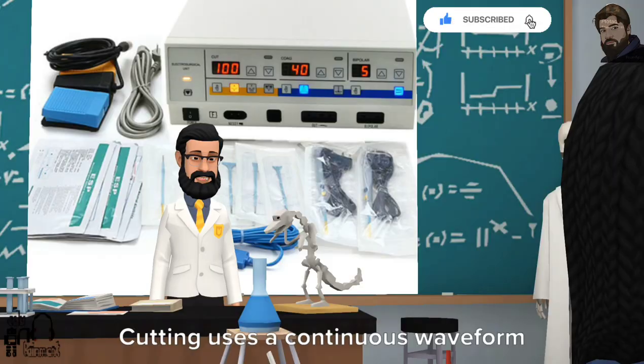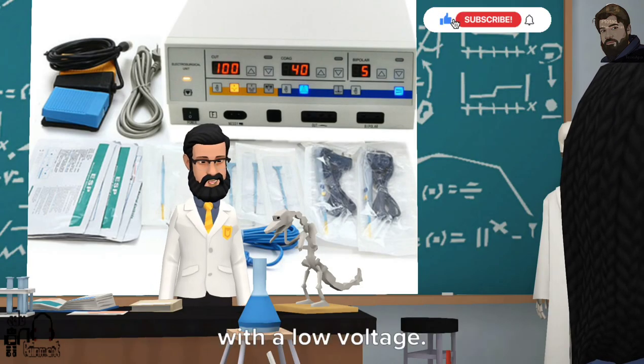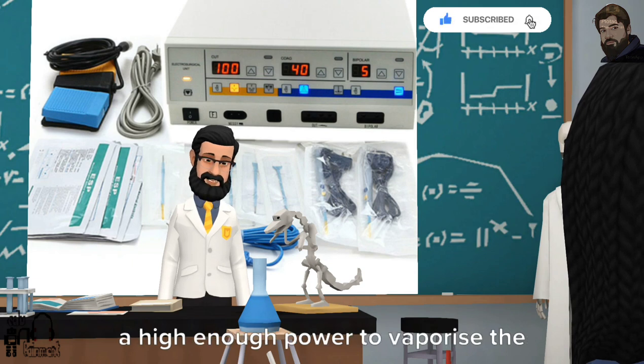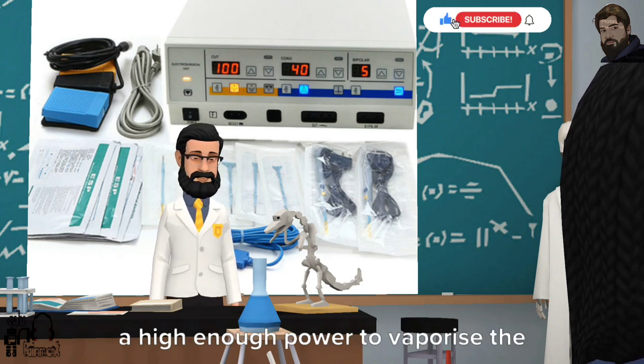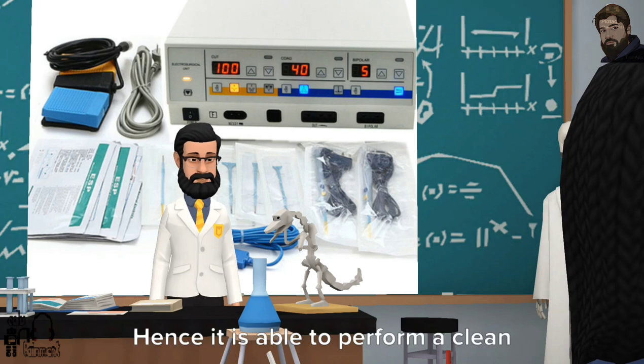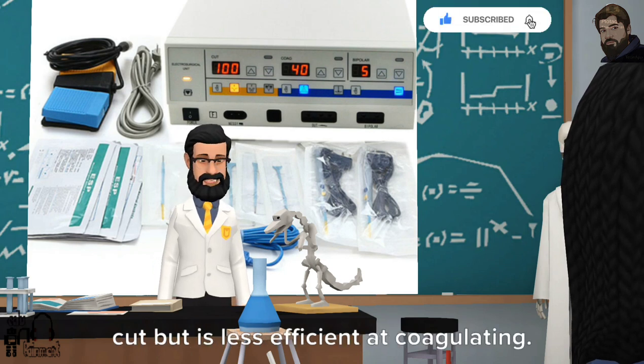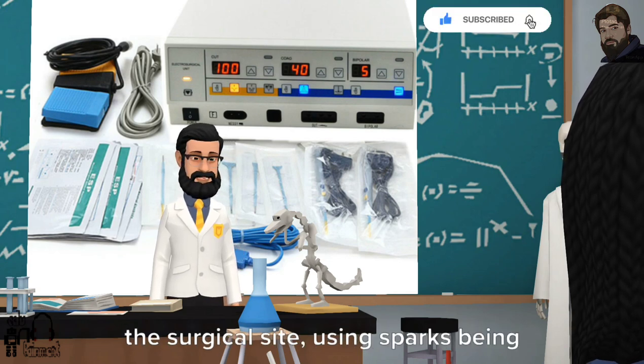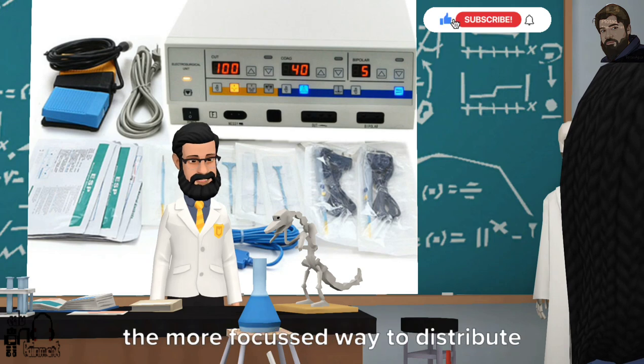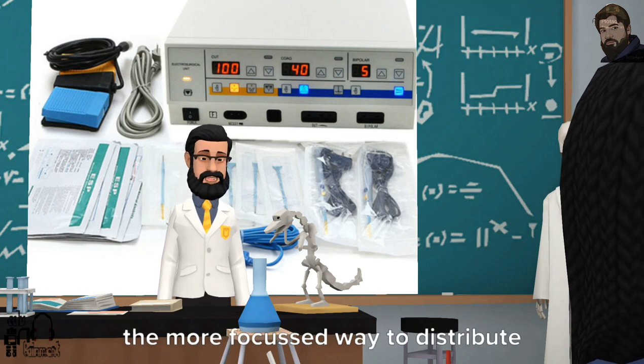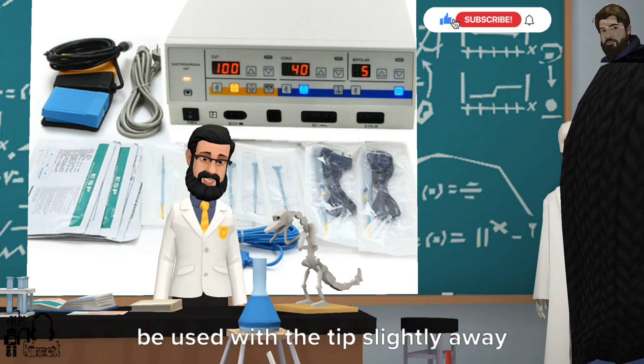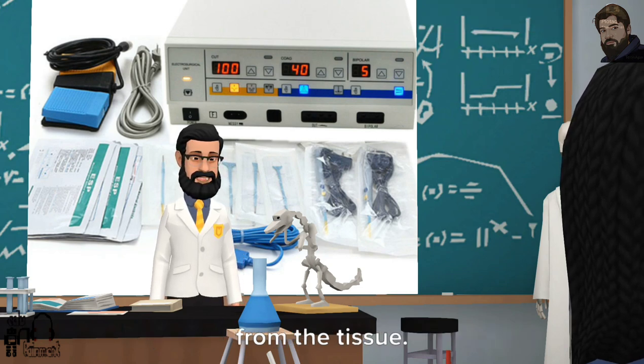What is cutting? Cutting uses a continuous waveform with a low voltage. In cutting mode, the electrode reaches a high enough power to vaporize the water content. Hence it is able to perform a clean cut but is less efficient at coagulating. The cutting mode focuses heat at the surgical site using sparks being the more focused way to distribute heat. The cutting mode should therefore be used with the tip slightly away from the tissue.